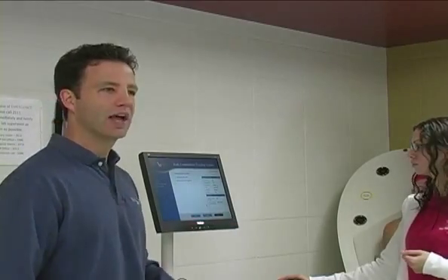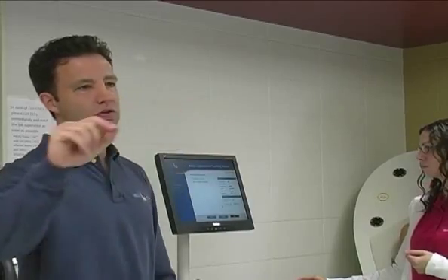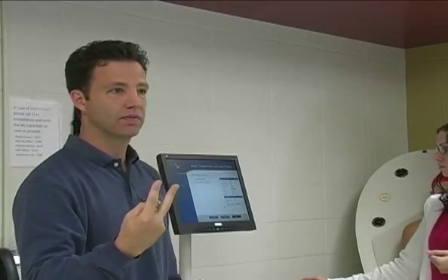So as I mentioned before, you want to remain relatively still because we are changing pressure in there. If somebody's shaking their leg or laughing, then typically you'll get the first two volume measurements inconsistent. We highly recommend a third, and then it takes the average of the closest two.